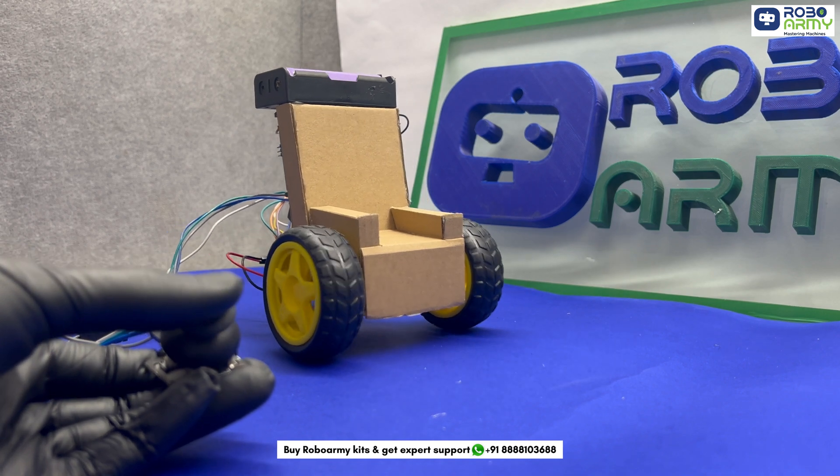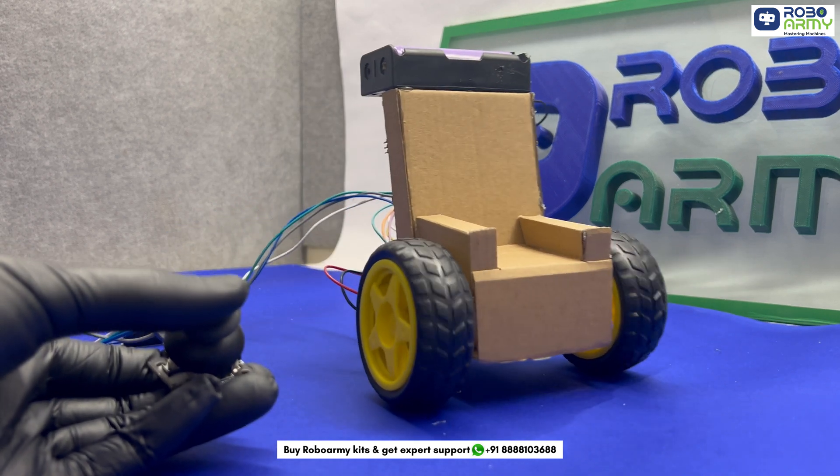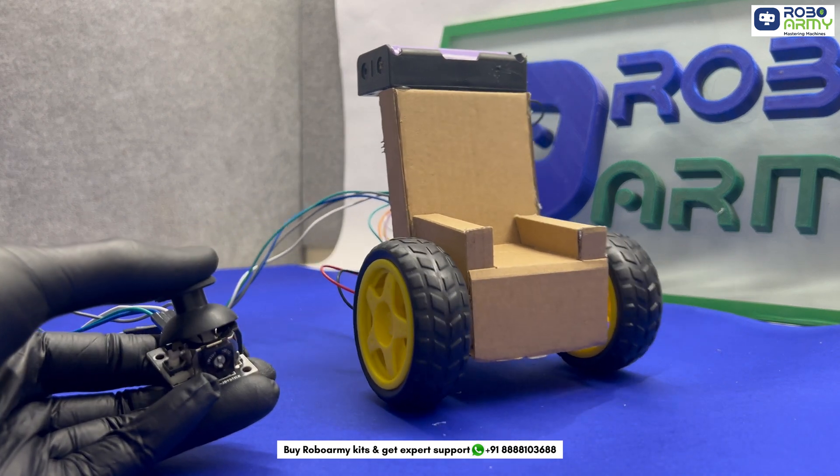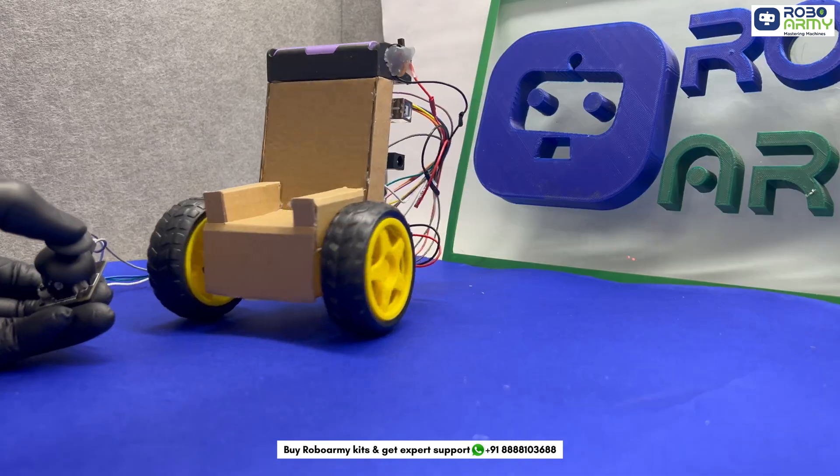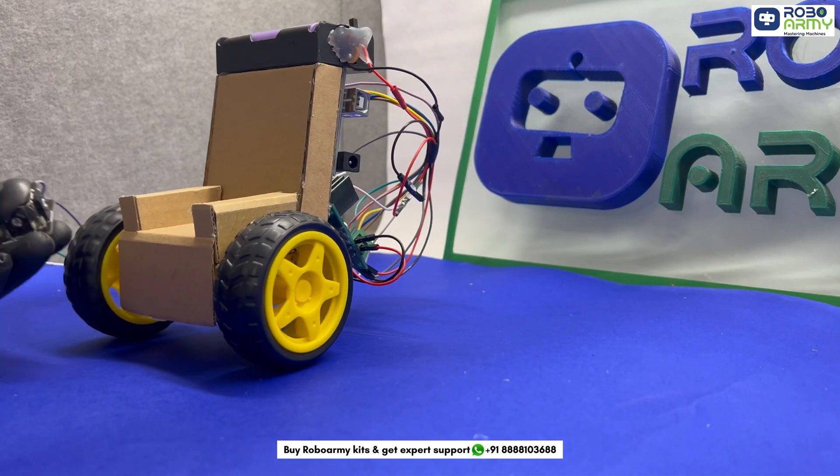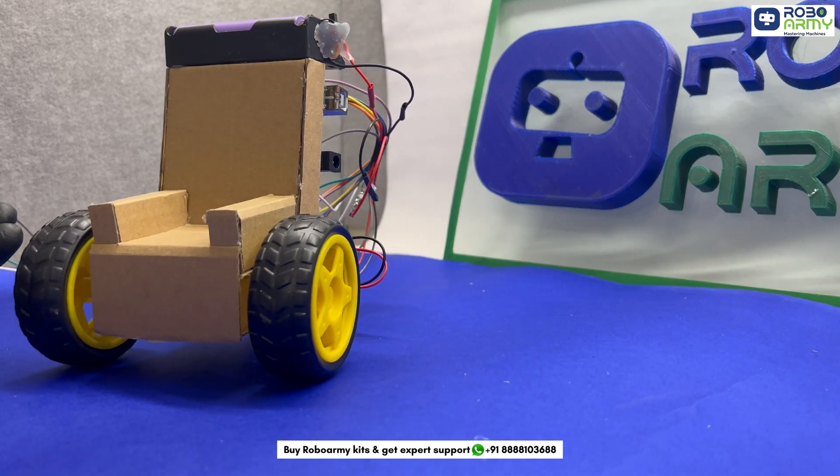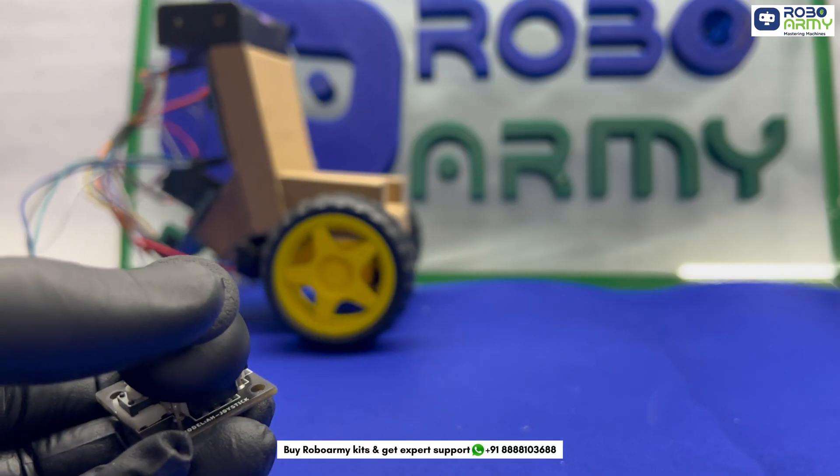Today we are building an Arduino-powered joystick controlled wheelchair. This project allows us to control the movement of the wheelchair using a simple joystick module.